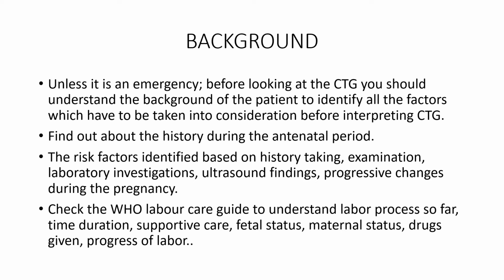Unless it is an emergency, before looking at the CTG, you should always try to understand the background of the patient to identify special factors which have to be taken into consideration before reporting. Find out about the history during the antenatal period, the risk factors identified based on history taking, examination, laboratory investigations, ultrasound findings, progressive changes during pregnancy, and also check the WHO labor care guide, which has been started for the patient in the labor room to understand the progress of labor and the process of labor.